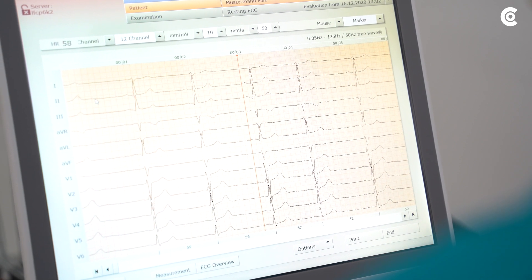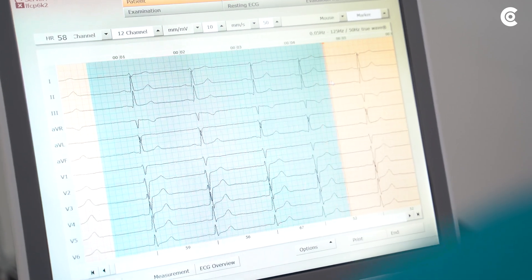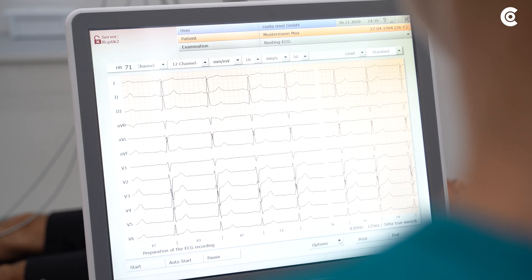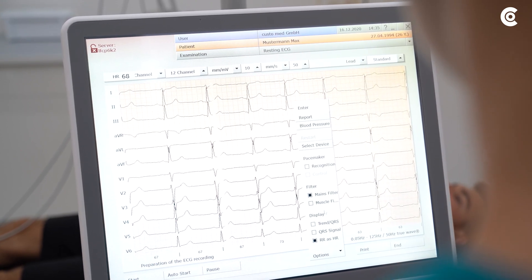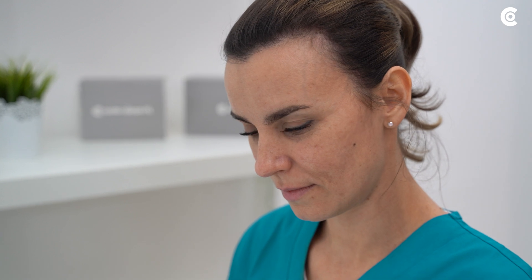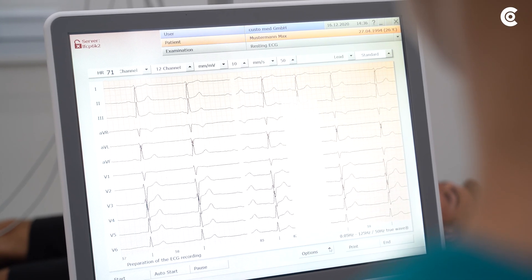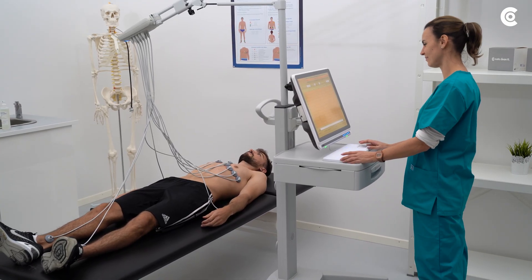You have the option to record longer and then select a 10-second section. You can additionally activate different signal filters to suppress disturbances in the ECG. A mains filter and a muscle filter are available. We recommend working with the mains filter as a standard and activating the muscle filter only in case of strong patient movements.